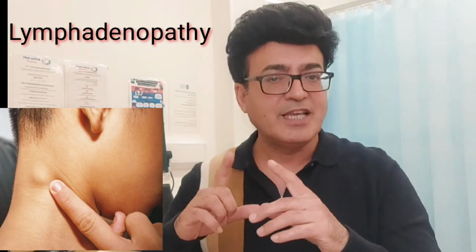I have selected this video. It will show you some enlarged lymph nodes in different areas. So just have a look, write your report, and expand your vocabulary and your medical knowledge regarding the differential diagnosis. So let's watch this video.